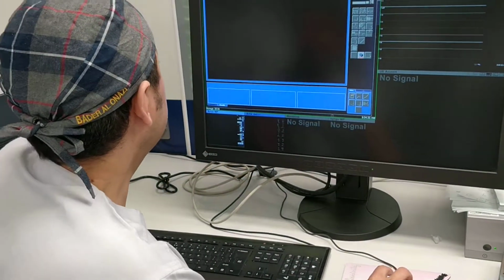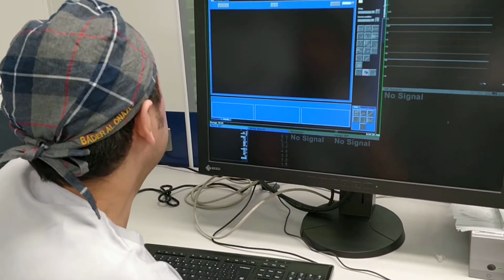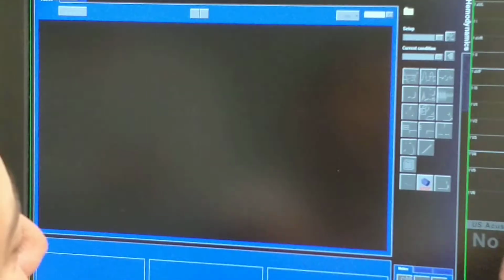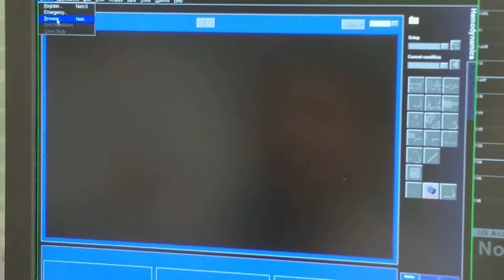So, as you can see here, if you press on an emergency patient, it's a bit tricky. If you move in here, you see it comes back again, but it only takes a single tour, and then it goes back again from here. Do you see that? So it's a bit confusing. As I mentioned, if you press an emergency, when you send the information to the PACS, it will take that emergency number. So please edit before you send the patient to the PACS.